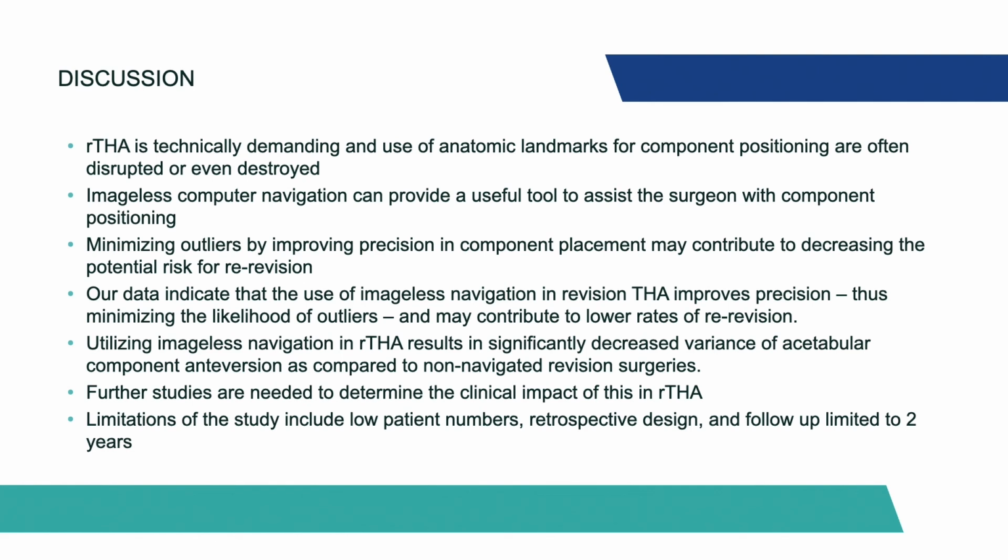Further studies are needed to determine the clinical impact of this in revision total hip arthroplasty, and limitations of our study include low patient numbers, retrospective design, and follow-up limited to 2 years.